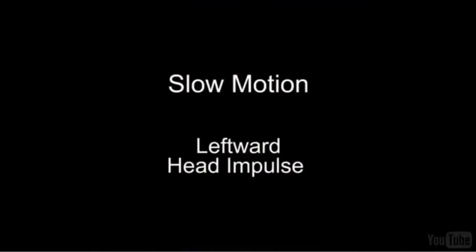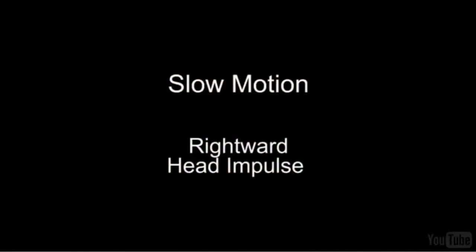So really look, can you see the catch-up saccade? It's very hard to see with visual observation. Now they're going to slow down the video. Head moves. Now the rightward. Head moves, and there's the catch-up saccade.